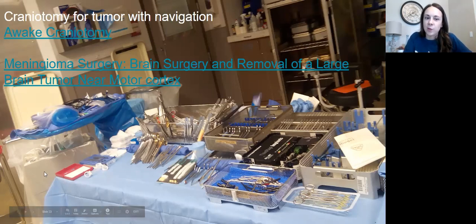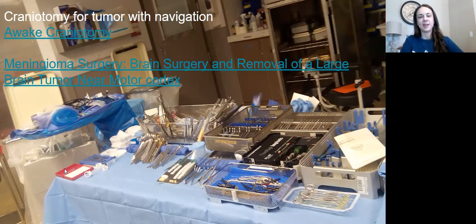This fluid warmer right here, this actually had cold saline in it. So every craniotomy is different. I told you that we can do craniotomies awake, right? So when our patient is awake, we need to be ready to stop a seizure. So even though you can't see it, it's on the other end of my table, I had some warm saline on the other end of the table.